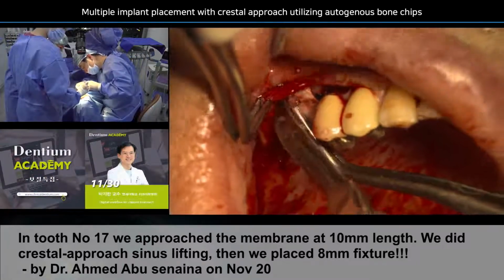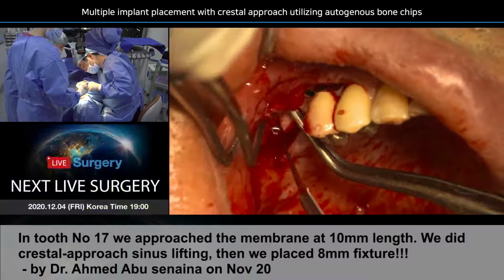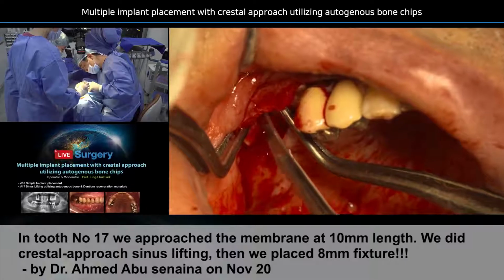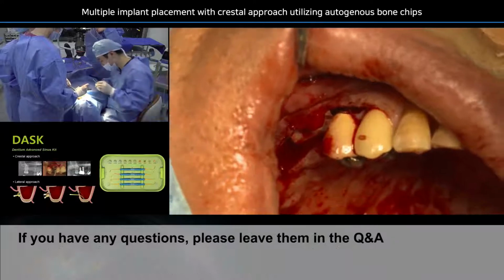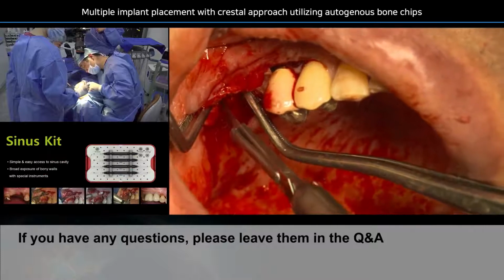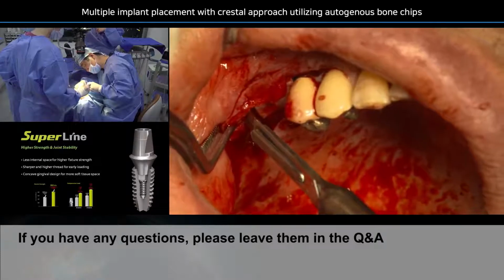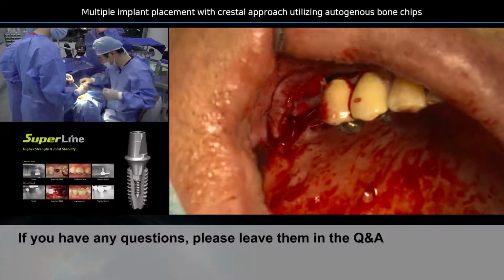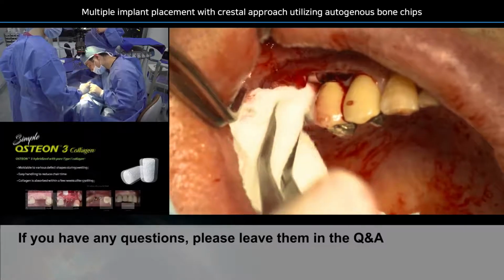Thank you. So I'm going deeper and deeper, cutting only a slight portion of the periosteum. I do not go inside the deep periosteum, but these days I make a little bit of scratches on the periosteum, and they give me better flap reflection. So these days the surgery has changed in many, many ways. So I think that we're almost ready. Yes, it looks like it.